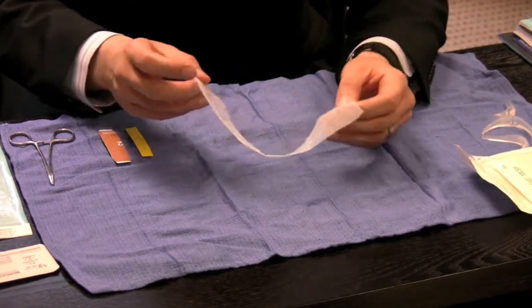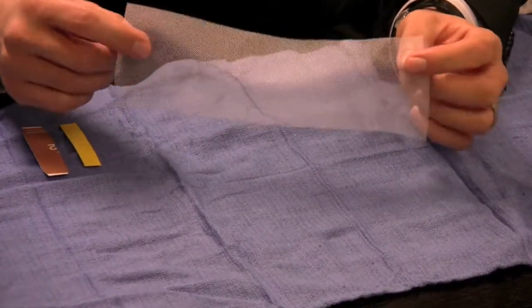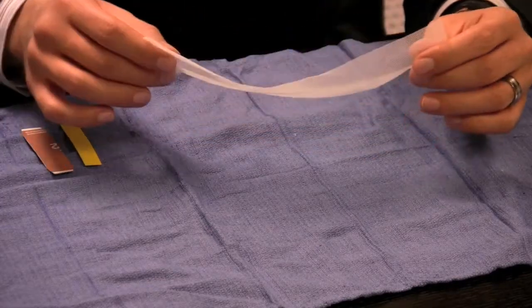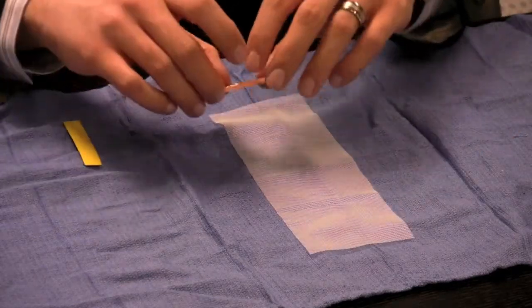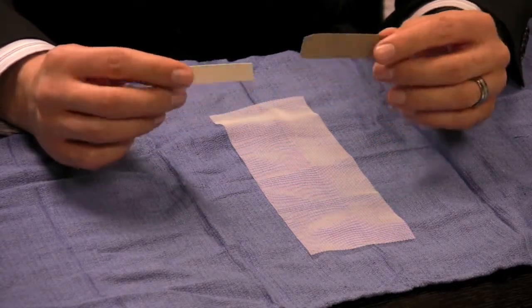And you can see that essentially it's a mesh. It's like a cheesecloth. However, it's a surgical mesh. General surgeons use this for repair of hernias and other places in the body. But what I'm going to do is I'm going to show you essentially how you make a chin implant. I have little cardboard cutouts depending on the patient's size and stature, and these are just arbitrary.